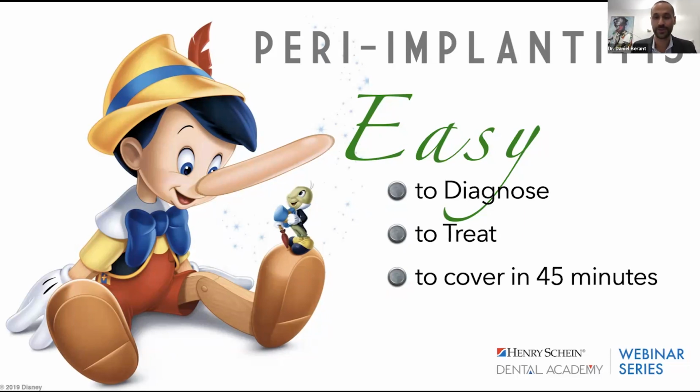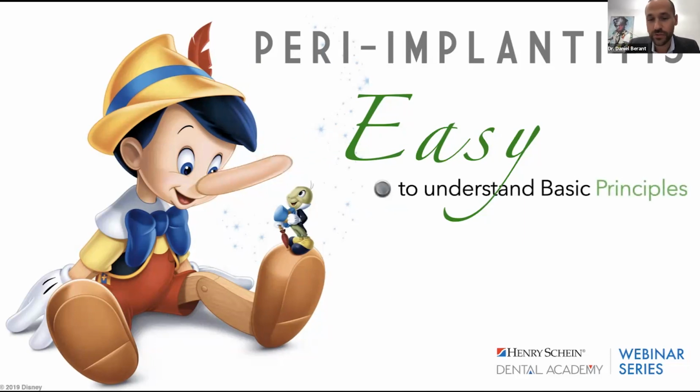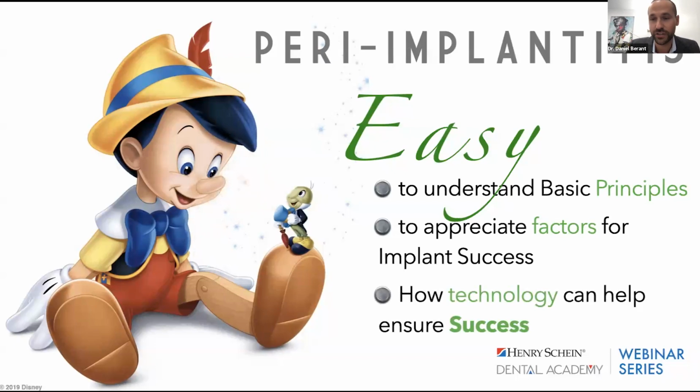In reality, what we're going to be talking about tonight is not the fact that it's easy to diagnose, treat, and cover in 45 minutes, but I'm going to do my best to help us understand the basic principles of implantology and how to reduce the chances of complications, so we can appreciate the factors that we can use to our advantage for implant success. And finally, and most importantly tonight, we'll be talking about how technology, both CBCTs and intraoral scans, can help ensure success. And so when you wish upon a star, you can save your wishes for something more than implants in your patients.